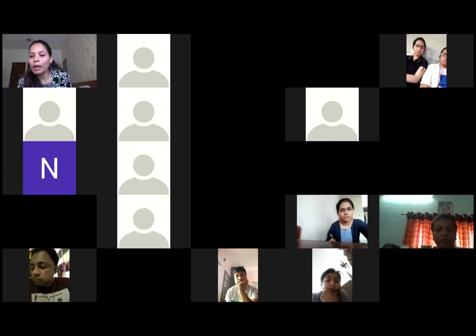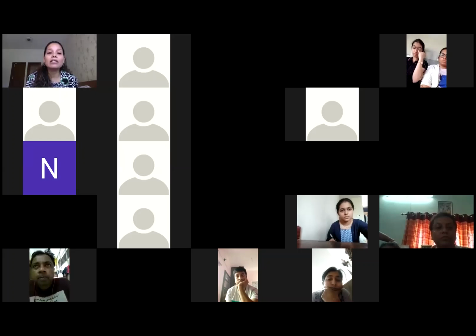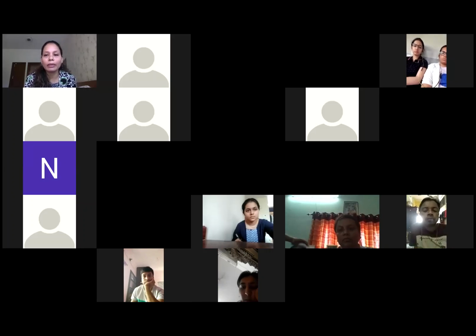Dr. Sonali Gupta asks, what target size do you use for Humphrey fields in eyes with poor vision if we don't have Goldmann fields available at our center? So nowadays a lot of people are doing Humphreys only. So we basically see on the basis of vision. If the vision is less than 6/36 or less than 6/60, you can try size 5. That is what you can try, but in that you will not get a pattern deviation chart. All you anyway want to know is whether there is any gross involvement. So many a time just looking at the grayscale, you can figure out, oh, this is what is anticipated. Maybe the patient is not very reliable, the gaze tracking is not good, but at least you get a fair and faint idea about what we are dealing with.